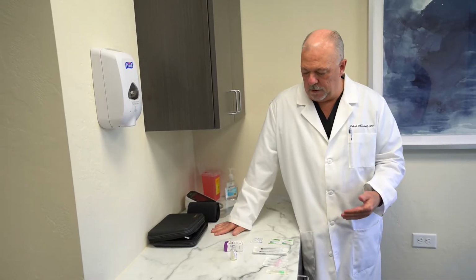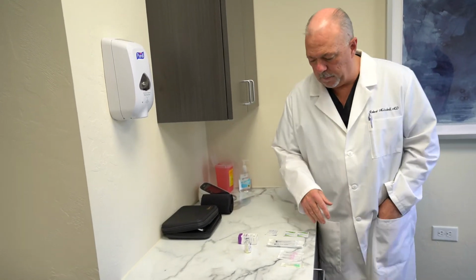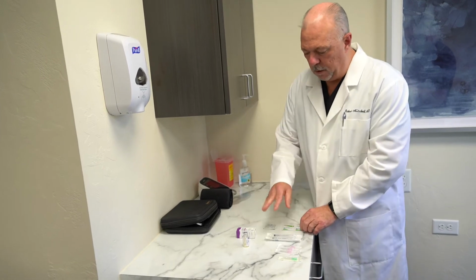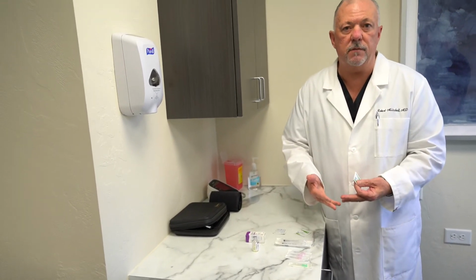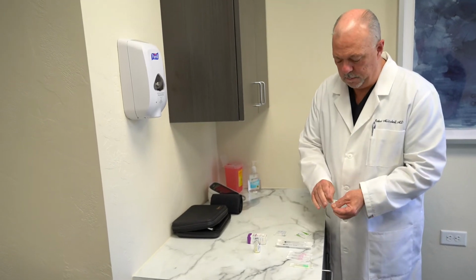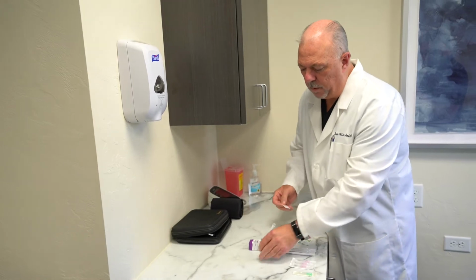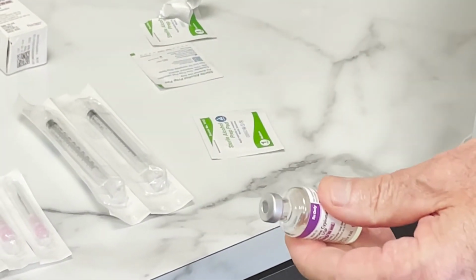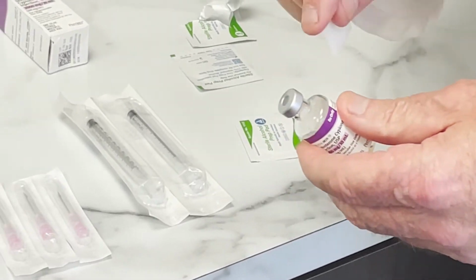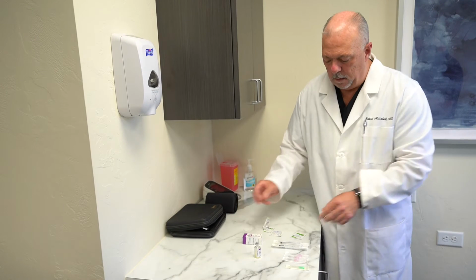And for this demonstration, we're going to go through how to load the syringe for an intramuscular injection. Each and every time, we'd like for you to start by washing your hands first. For this demonstration, these alcohol swabs that are provided in your box, we just want to clean the surface top, which is a rubber plunger that we place the needle through, so that it's nice and sterile and clean and ready to load that medication.